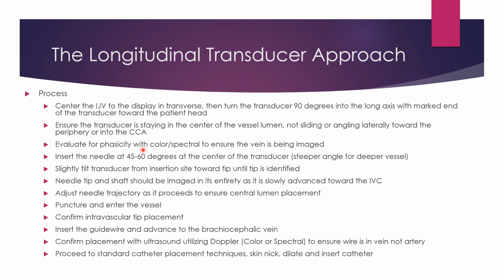As you do this, slightly tilt the transducer from the insertion site toward the tip until it's identified. And sometimes you might just have to sweep your hand side to side a little bit, very, very minimal movements, to get that needle centered to the transducer. And once it's centered to the transducer, then you're just going to keep that transducer on it as you advance the needle.